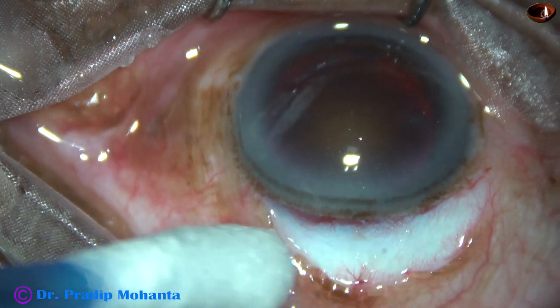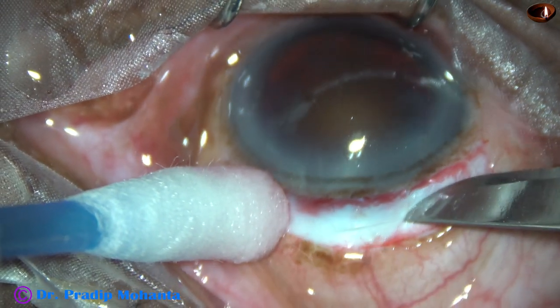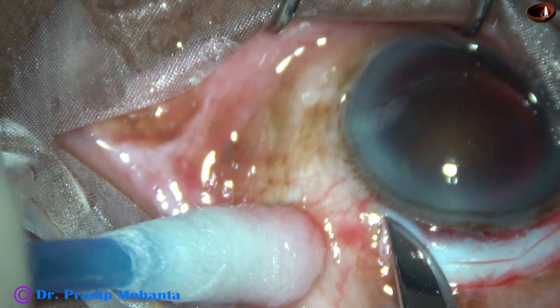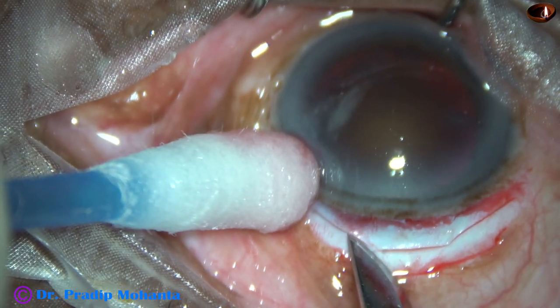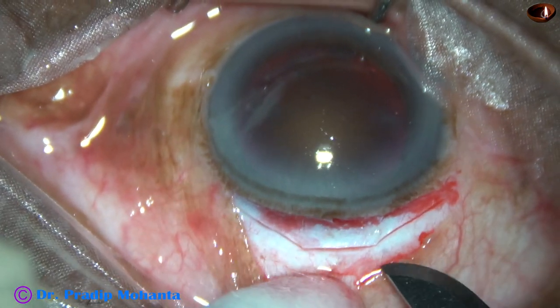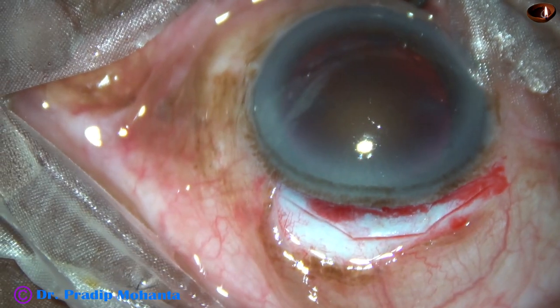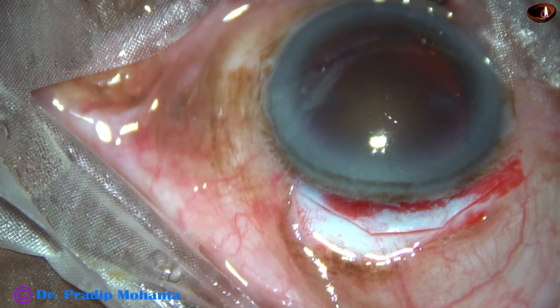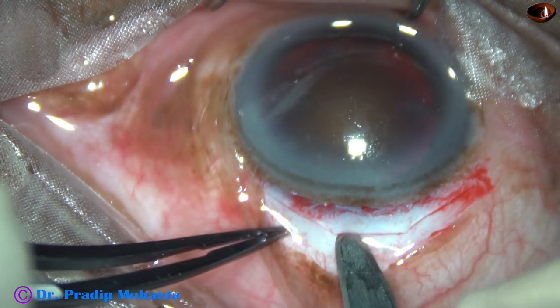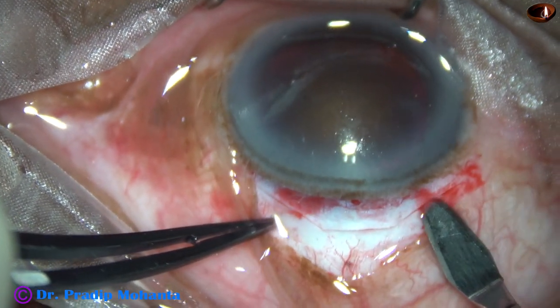And now this is the incision — a straight incision and on either side of it another two incisions. So we have got, you can see, about a trapezoidal incision. The size of this incision from one end to the other end is about 9 mm. And now I am going to do a sclerocorneal tunnel as we do in small incision cataract surgeries.